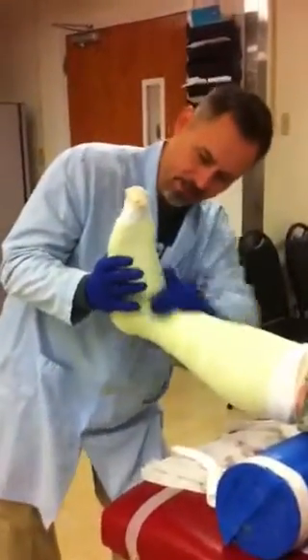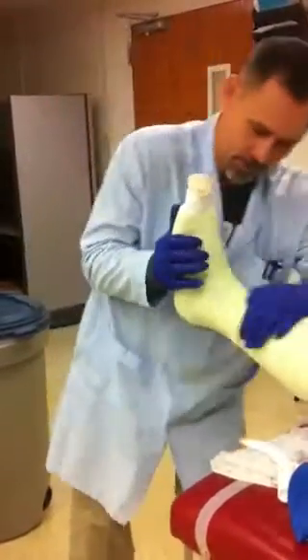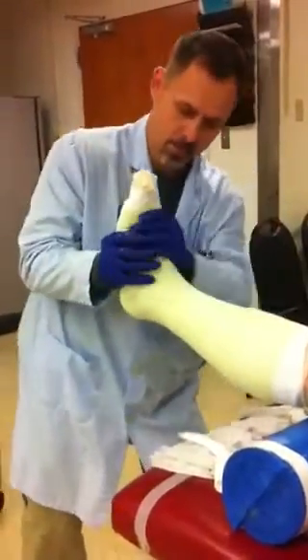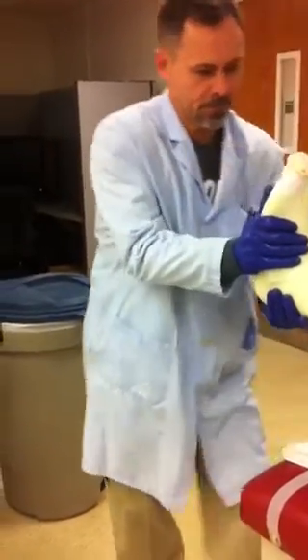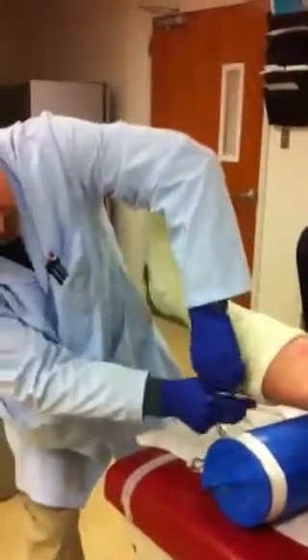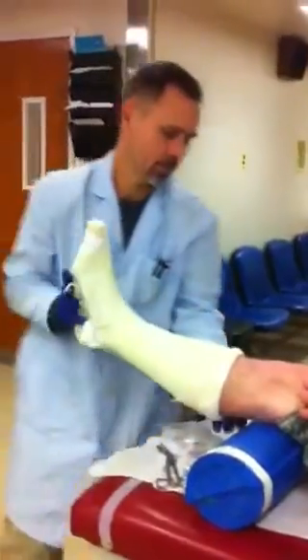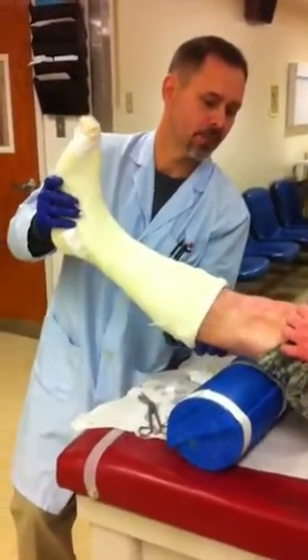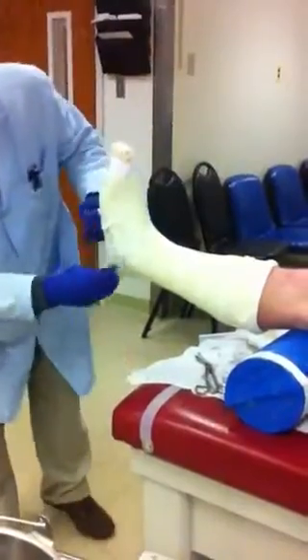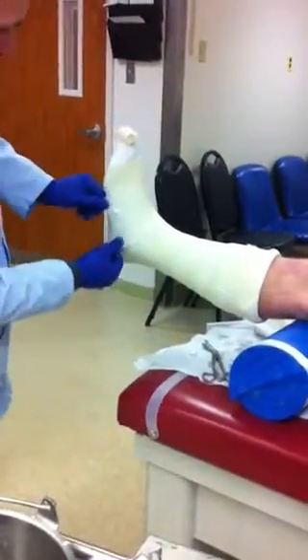The position of the foot has to be 90 degrees unless otherwise specified by the doctor. In this case we're going to have 90 degrees — meaning the angle here, 90 degrees. The cast should end about two inches below the bend of the knee so the patient is able to bend the knee without any impingement. So that's a good distance there that we've got it.